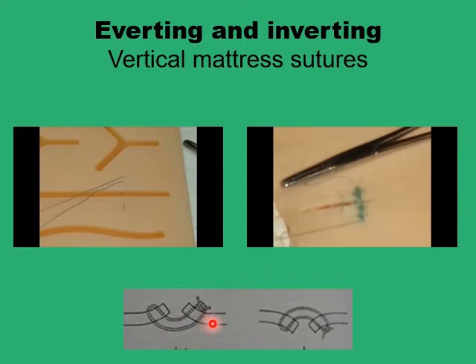So if you have it everted, this will compensate for the inevitable depression of the wound during the healing. This is provided because you have two loops here. One of them is smaller and more superficial, and the other is longer and deep, and this configuration allows for the wound edge to evert.